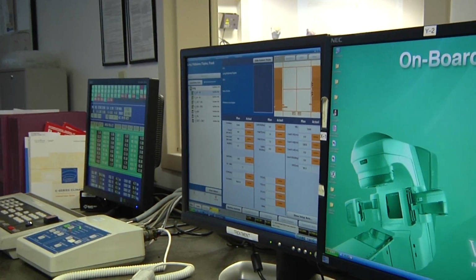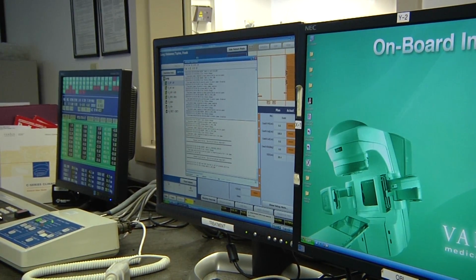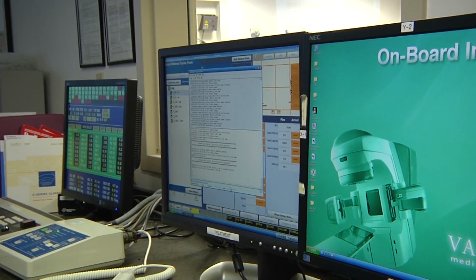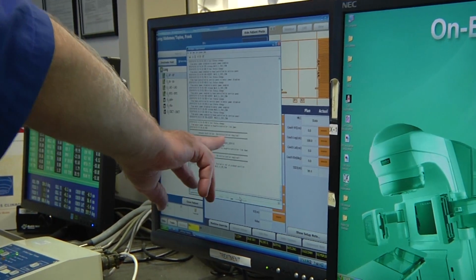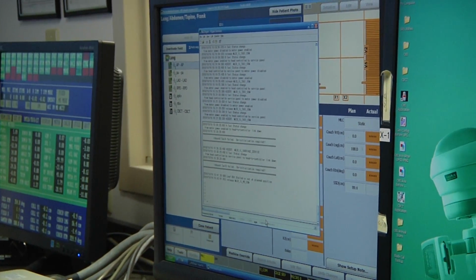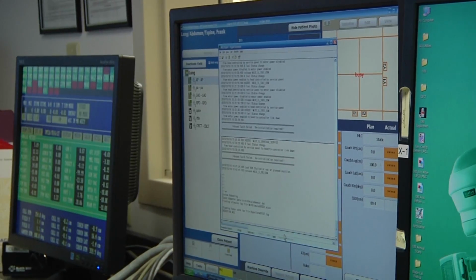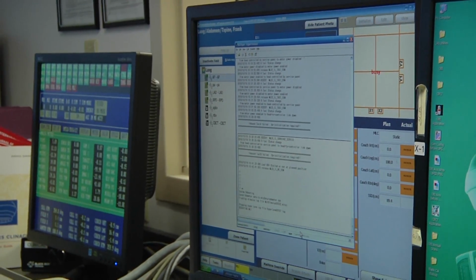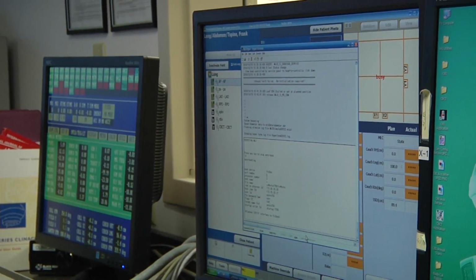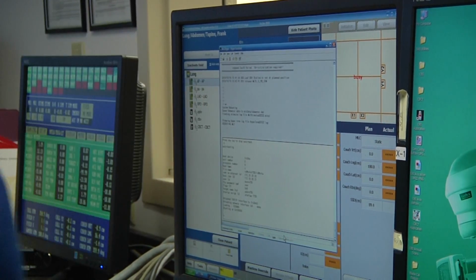So hyperterminal is down here, usually running when you start up your system. So you can click on that, and it'll come up. So whenever I get into this screen, I just hit the keyboard a few times. That makes sure that I get movement in the window, since you share the same keyboard in between computers. Type in the command WR. What that is doing is rebooting the program that's actually on this workstation and goes over to the controller. So the controller looks at the workstation for the program. And this just shows you that communication link.